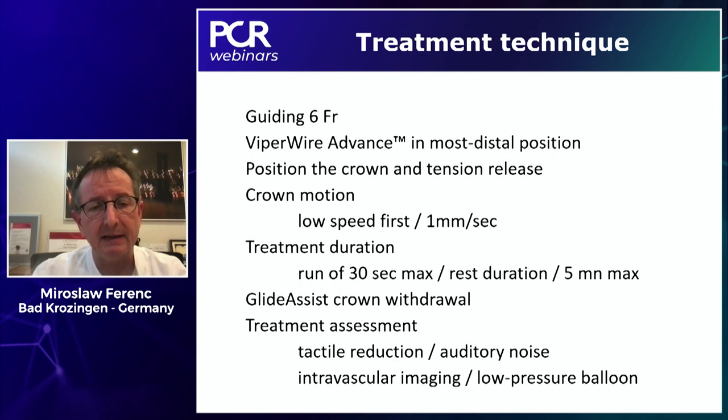And what is really, from my point of view, also important, you don't have big bradycardia problems. So we usually don't give atropine in our patients. And there is no problem with hypotension, because if you ablate, there is still some residual flow in the coronaries. And also, from my point of view, a very important topic in daily routine. Okay, so these will be, from my point of view, the most important points in daily routine. Okay, I give back to Javier.